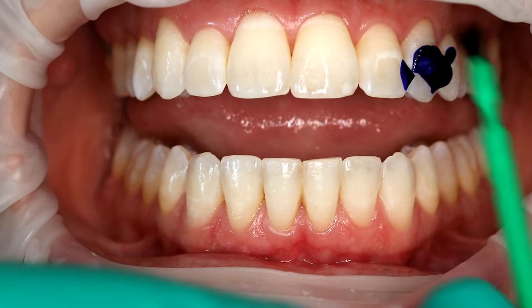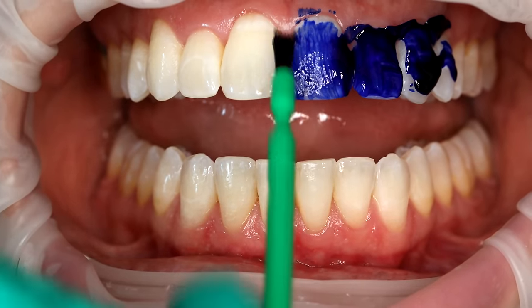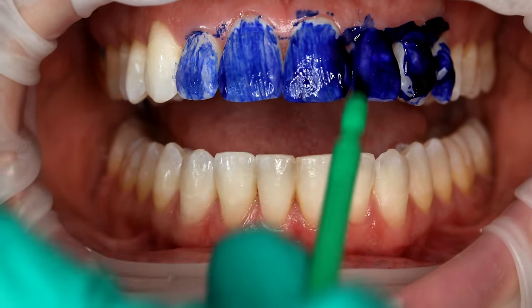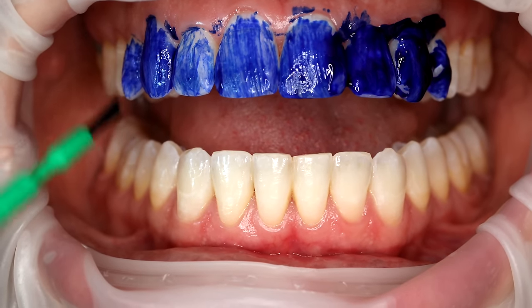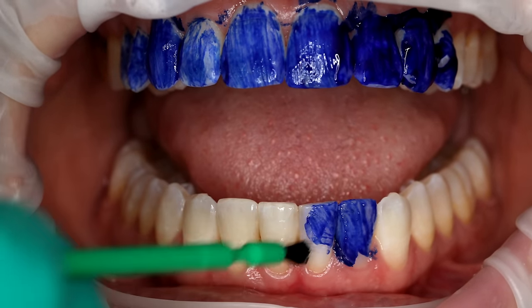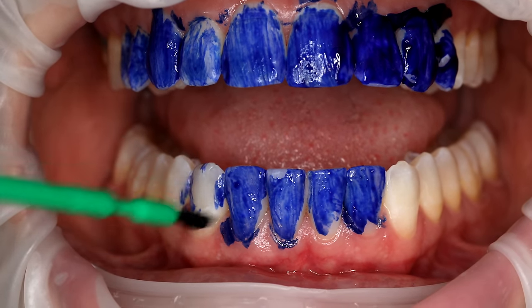All right, so let's get to it. Let's put the disclosing agent on the teeth just like we did before, because this really shows us where everything's at and how we work around it. We're going to be highlighting the most comfortable way to clean your teeth, but I just want to clarify a couple things in the context of this video. Of course, there are many factors that will affect how comfortable a cleaning or hygiene visit will be for each patient. As we've seen, instrumentation and technique is key, but there are many factors that cannot be controlled.